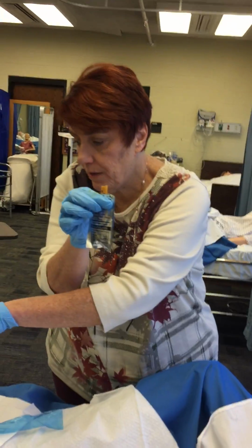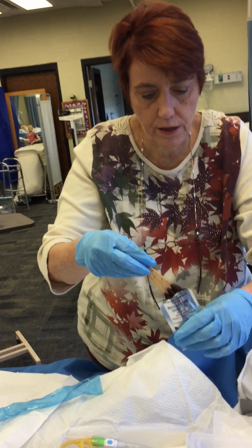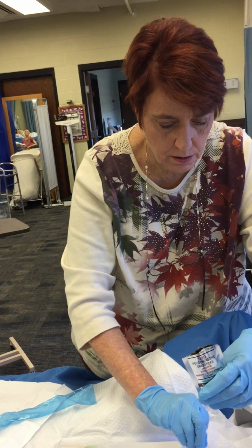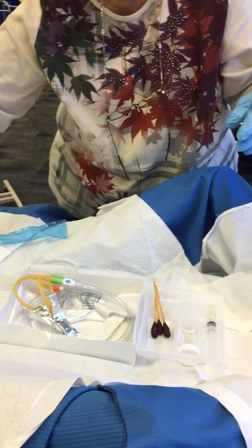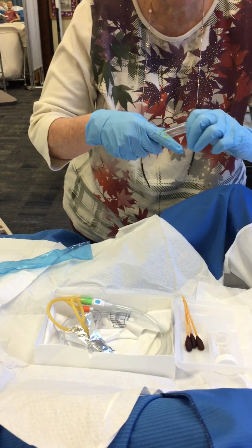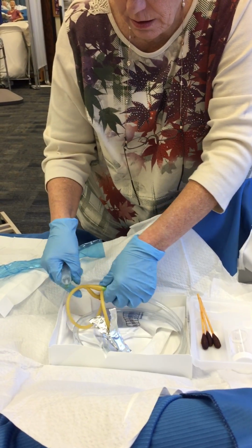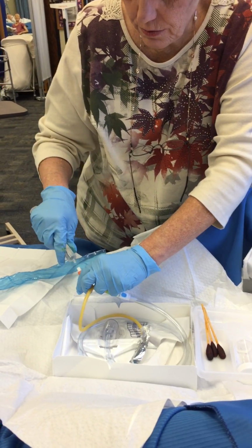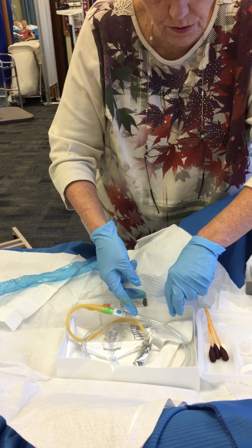These are why this bag is so important, because this will stain. I'm going to go ahead and take my swabs out. Put them there. It's all sterile, right? This is my saline that's going to be blowing up the balloon once we get the Foley in, and we're going to attach this right here. Make it easier than doing it with one hand.